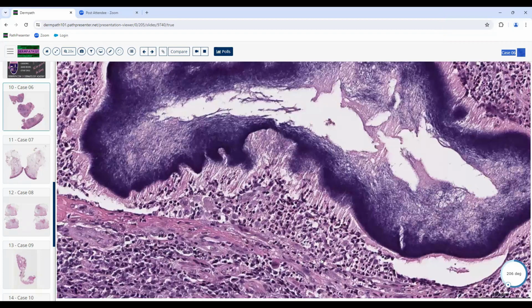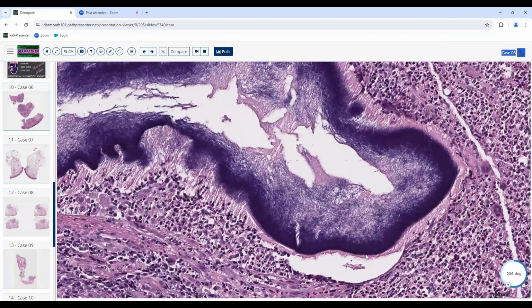Is it because it looks more filamentous than gram-positive cocci? Yes, exactly. Botryomycosis is gram-positive cocci, so you're going to see round organisms glued together, growing like a column. Here, we do have filaments. This is almost like a spider web, like cotton candy. So what organisms are these?